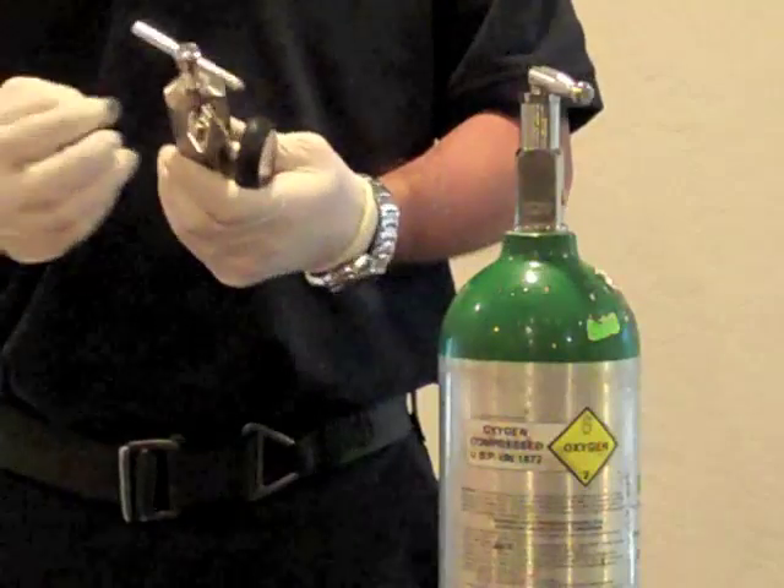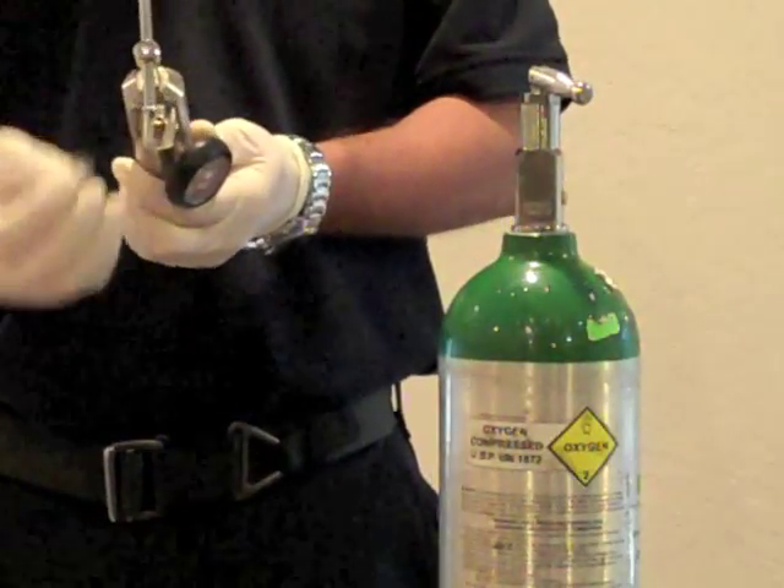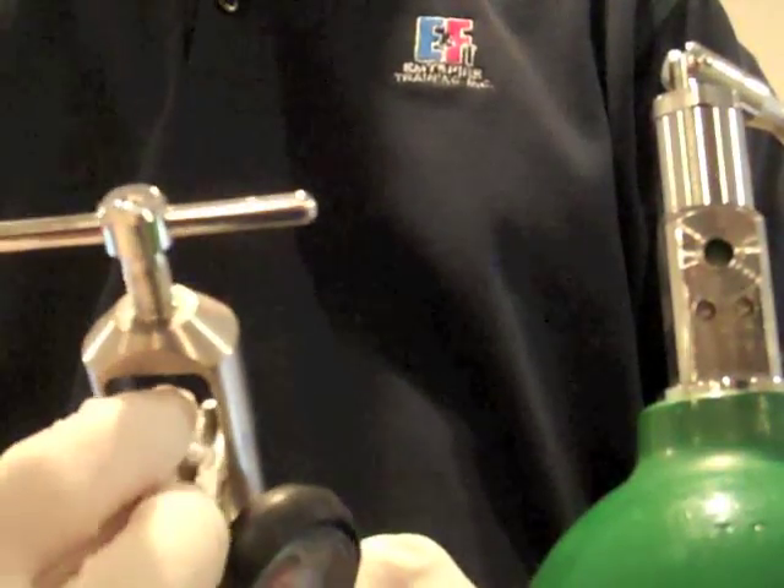Assemble the regulator and oxygen bottle, making sure that you have the correct gasket or O-ring and that it is properly seated.